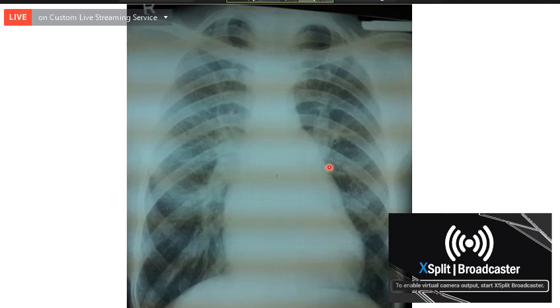What are the X-ray evidences of pulmonary venous congestion? You said: 1, the upper lobe vessels are prominent; 2, Kerley B lines; 3, perihilar prominence; perihilar cuffing.